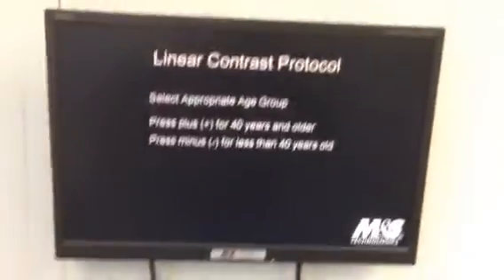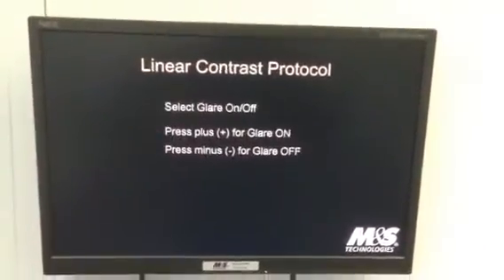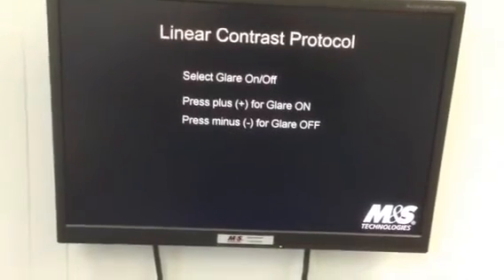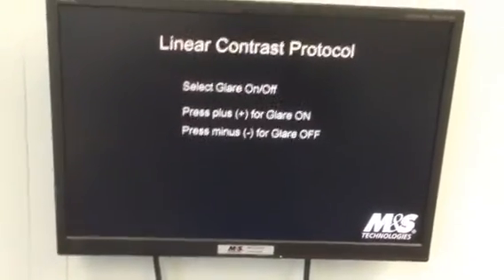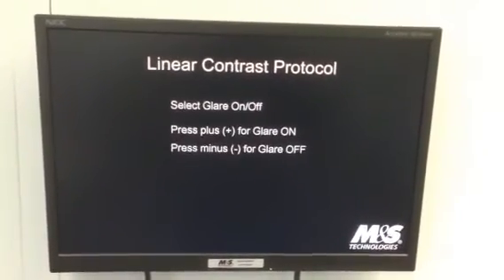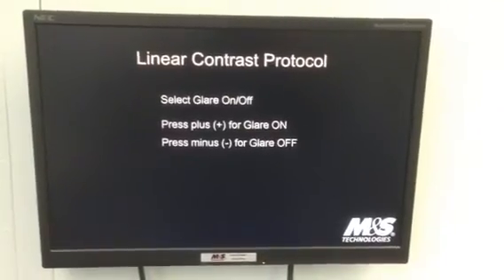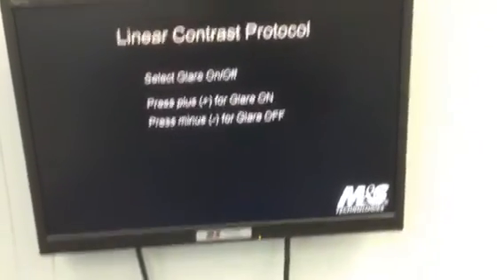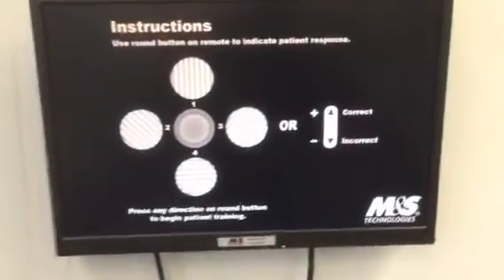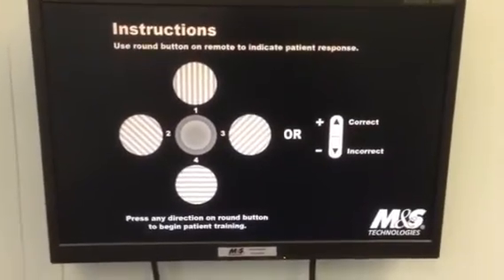You'll then get to choose which age group you're working with, I'll say over 40, and whether you want glare on or off, if glare is available on your M&S chart. And then when you go past there, it's going to give you some instructions for the remote about how to answer.